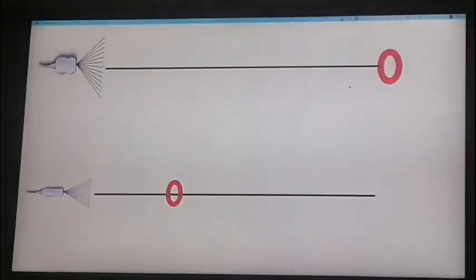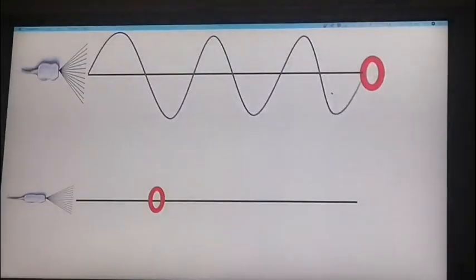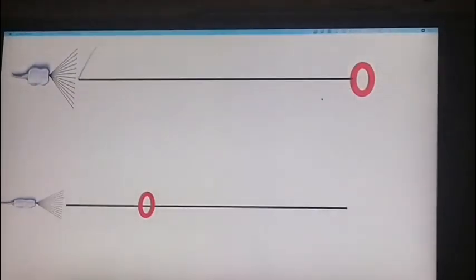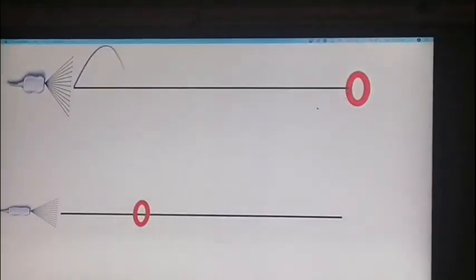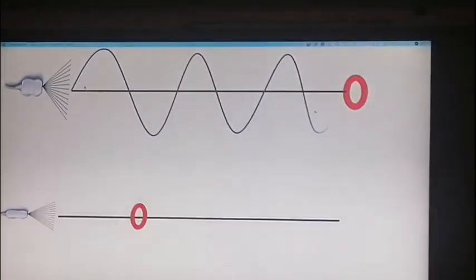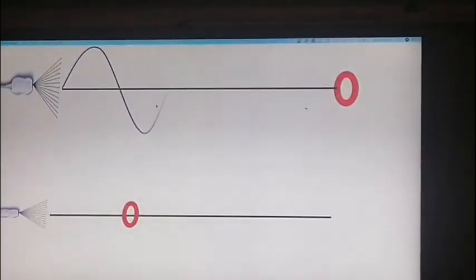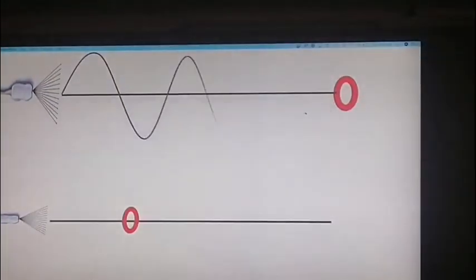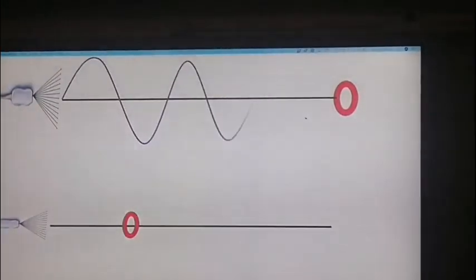So the physics of ultrasound. Ultrasound is waves. It is called ultrasound because it's beyond our ear to detect. Our ear can detect between 20 to 20,000 hertz, that's the maximum. But for ultrasound we are using millions of hertz per second. Each wave above a baseline and back to the baseline is 1. And then we have 1 million per second of each of these waves. It means 1 megahertz. So this is the range that we are using.